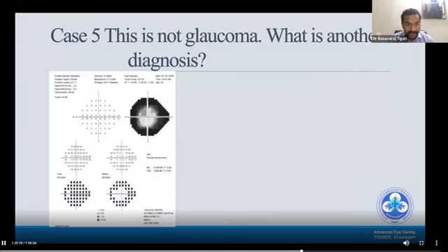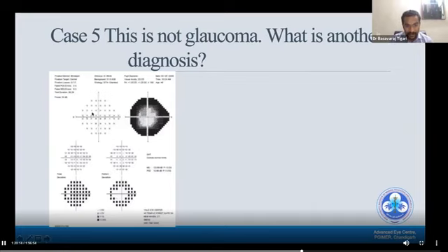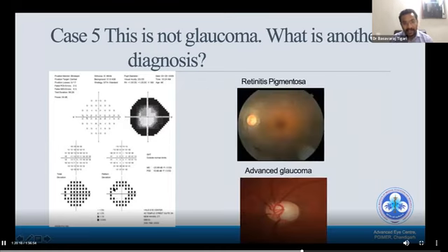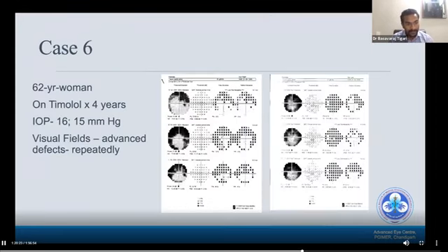Last case: this is not a case of glaucoma — what is the diagnosis? There is peripheral field loss with the central part spared. This pattern can be seen in retinitis pigmentosa or advanced glaucoma.